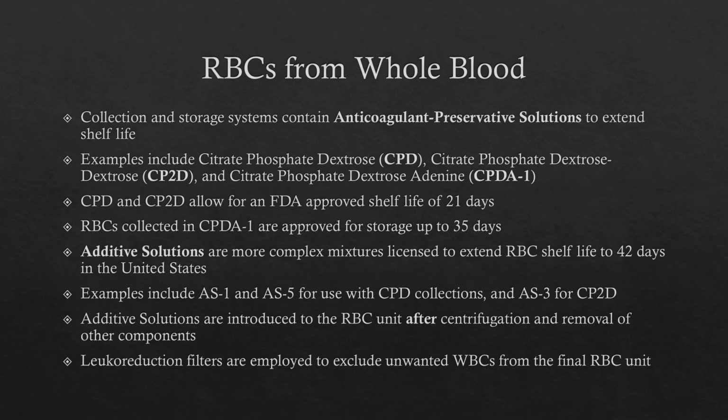Now, 35 days is pretty good, but there are additive solutions that are more complete mixtures, a more complete preservative that you can use. You can't use an additive solution with CPDA1, but you can use it with CPD and CP2D. And even though CP2D has twice as much dextrose as CPD, they both can benefit from the use of an additive solution.